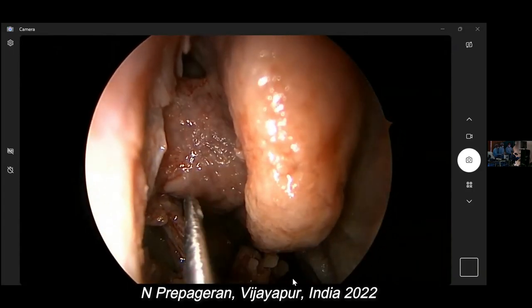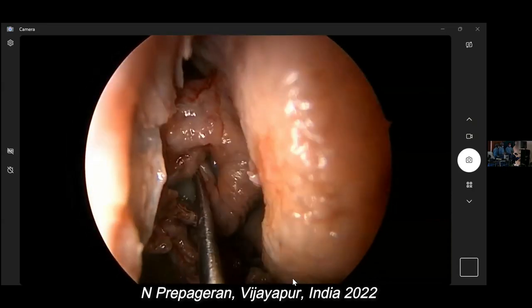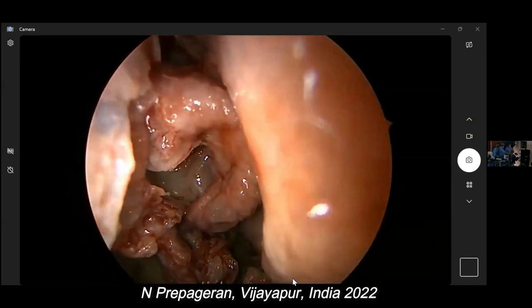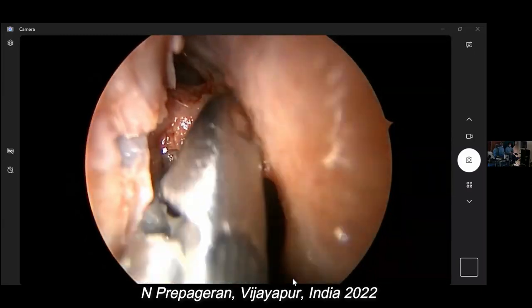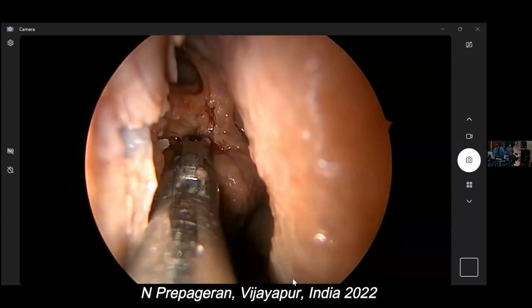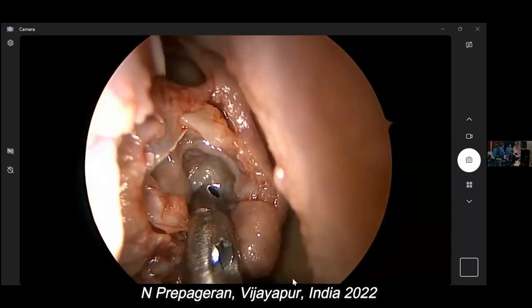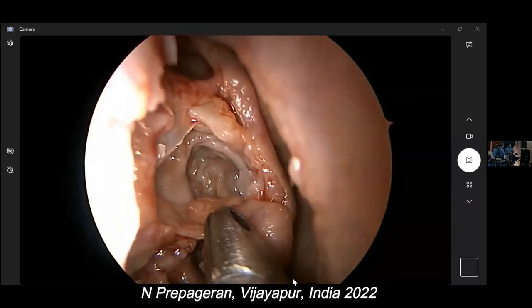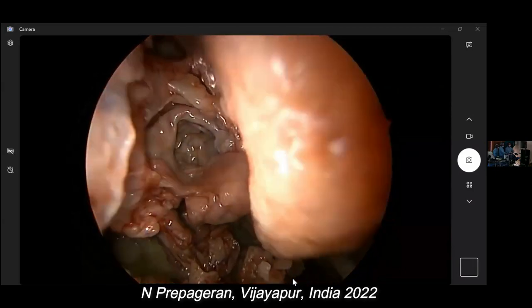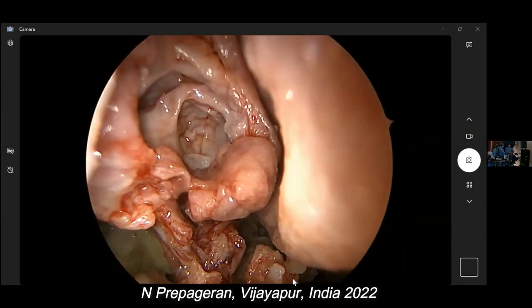So where do you go in for gate number two? You go in right in the center and open up the space. You're inside the bulla. So you can see the difference between a fresh frozen cadaver and a soft embalming. Soft embalming. So you open this and you preserve the mucosa. Can you see? So uncinate is open, gate number one. Gate number two, the bulla is open, and I preserve all the mucosa.